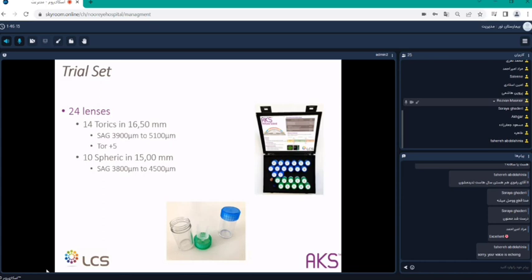To be able to fit the scleral lens, you need a trial set. Actually, there is no other precise way to fit any scleral lens without a trial set. This is very helpful for practitioners, because even if you need this trial set in order to define the right parameters of the final scleral lens, that is also a good way to show the patient how comfortable the lens is. And that is useful in order to motivate the patient, because you have, as a practitioner, to present the option you're going to offer him.